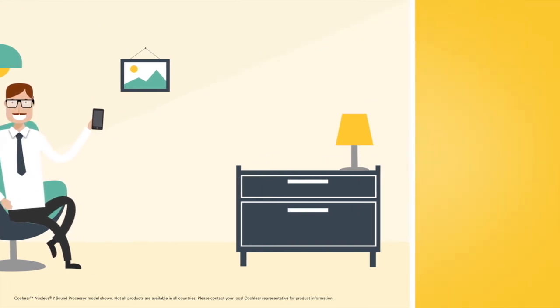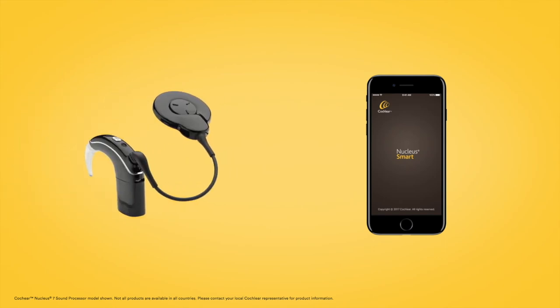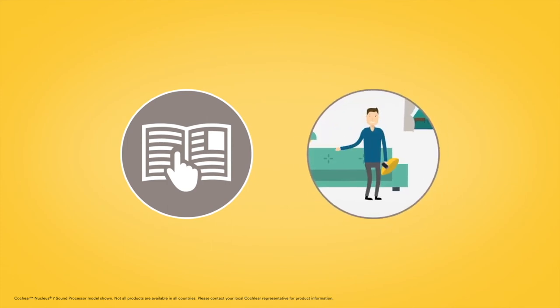To start using the Nucleus Smart App with your Nucleus 7 sound processor, you'll need to pair your sound processor to your compatible Apple or Android device. To pair with your Nucleus 7 sound processor, follow the instructions in the Nucleus 7 pairing guide or watch the How to pair animation.